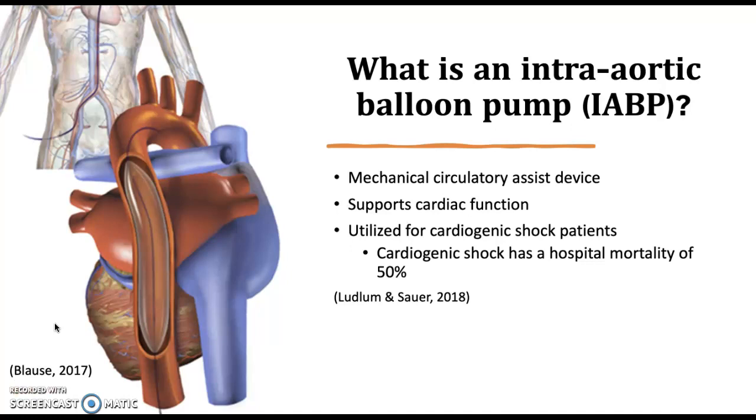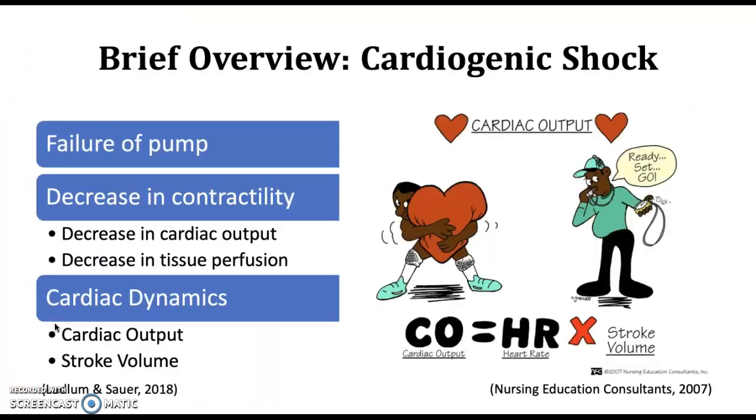The intra-aortic balloon pump is also temporarily used along with pharmacological interventions to help improve cardiac function and is mainly used for patients in cardiogenic shock.